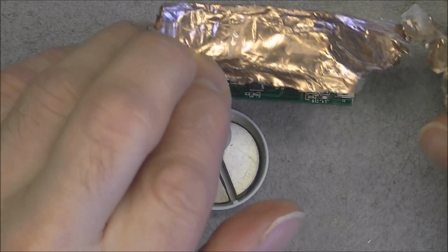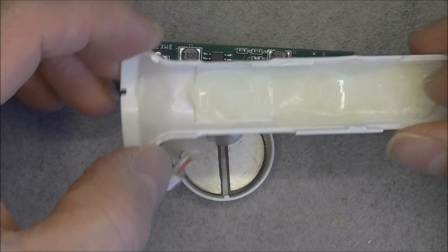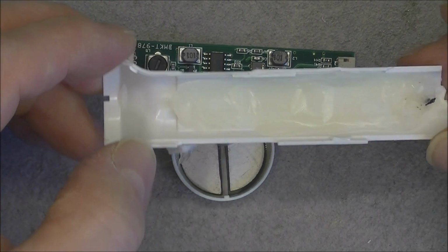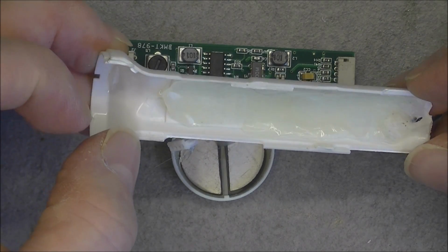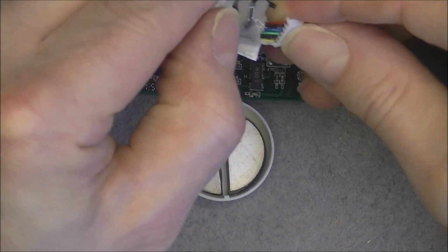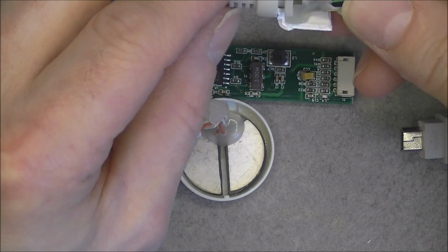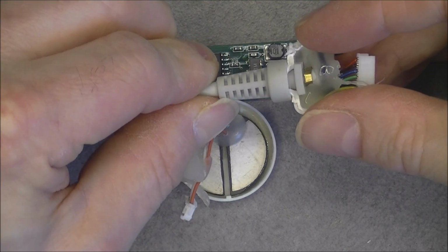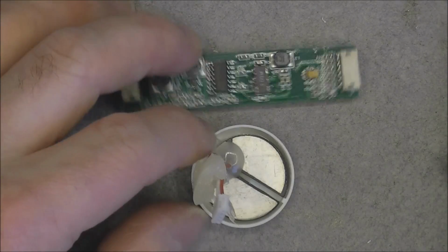But I can recycle some copper foil. And as you can see, yes, they were pretty generous with hot glue in here to hold it in place. And this wire, we have 6 or 7 wires with one extra ground. Pretty good strain relief here, and some kind of micro USB-ish plug.